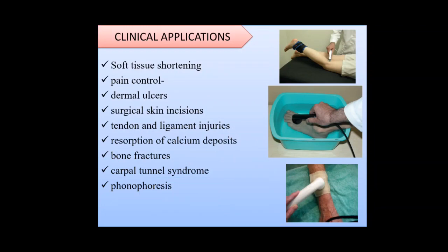Then coming to the clinical applications, you can apply ultrasound on soft tissue shortening, pain control, dermal ulcers, surgical skin incisions, tendon and ligament injuries, resorption of calcium deposits, bone fractures, carpal tunnel syndrome and phonophoresis.